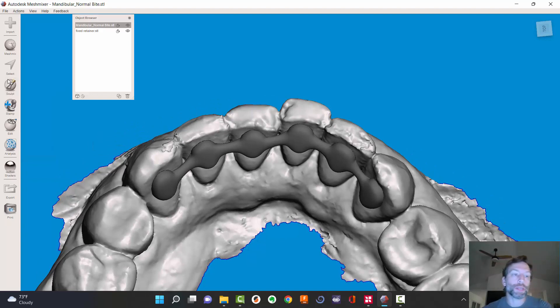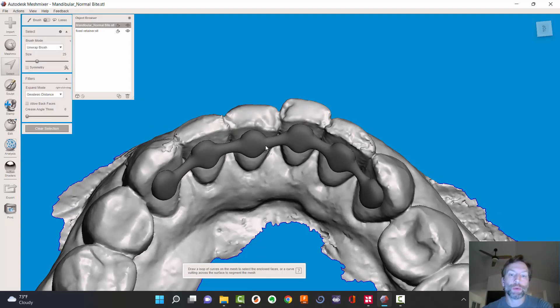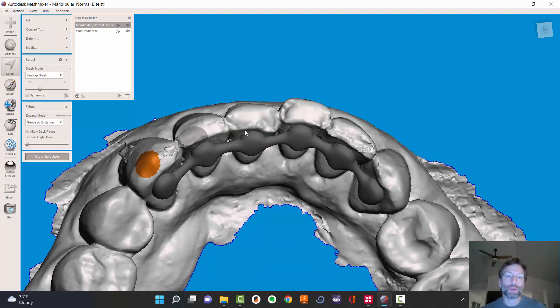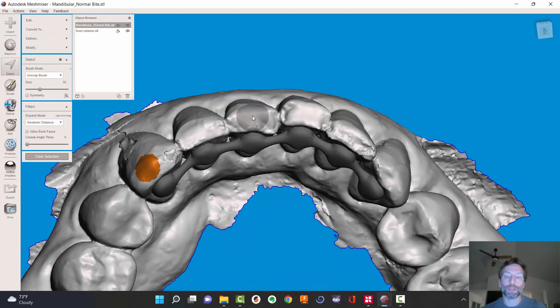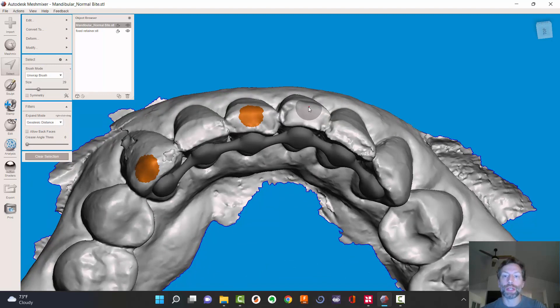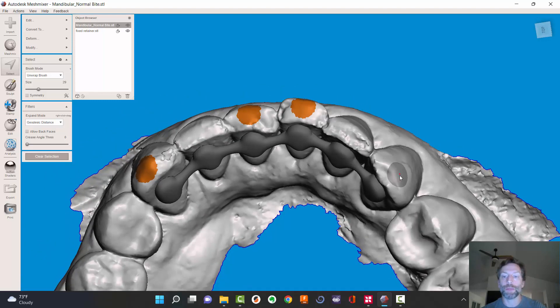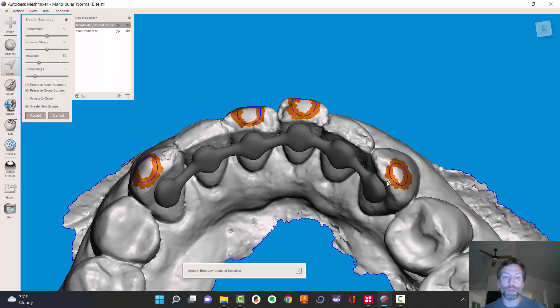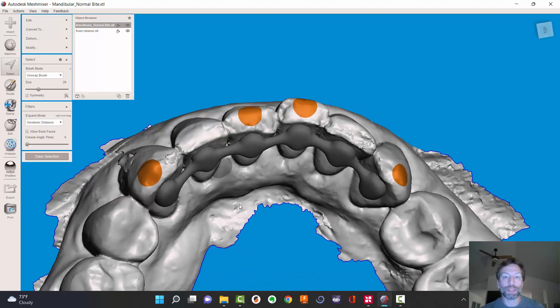At this point, all I need to do is hit the select button, just like we did when we make the pads, but now we're going to make some rest seats on these other teeth. We want these pretty big. You might be thinking you know what he's going to do — bridge these over and lap them onto it, then cut them off the retainer. Honestly, that was my first idea. Let's go ahead and hit B to make nice smooth things.